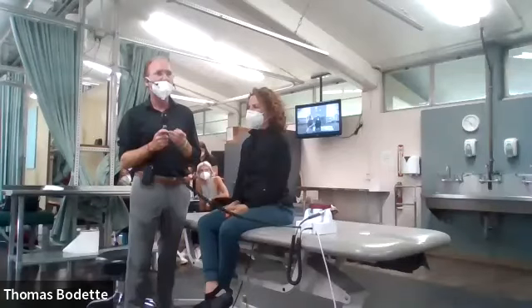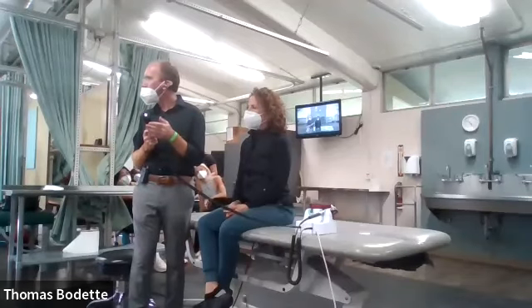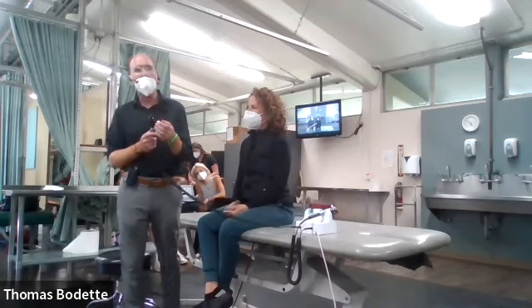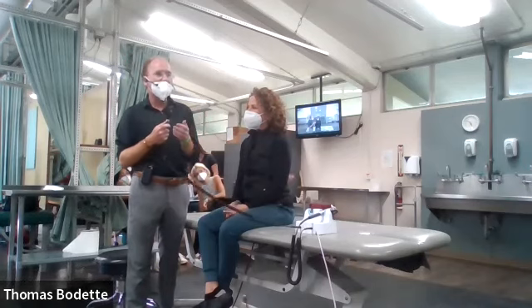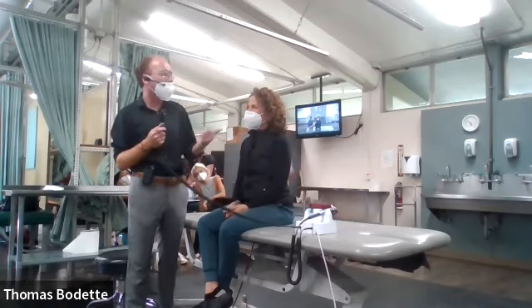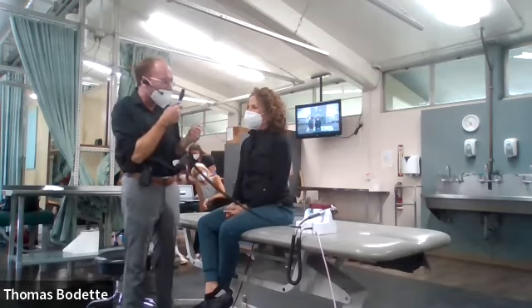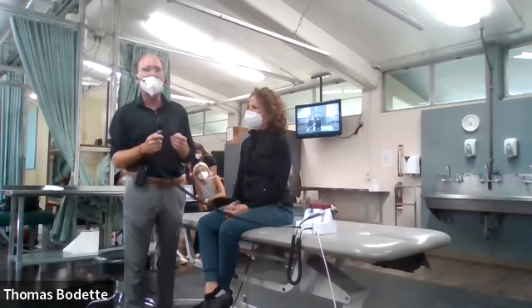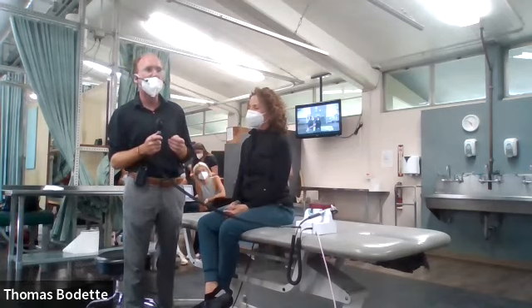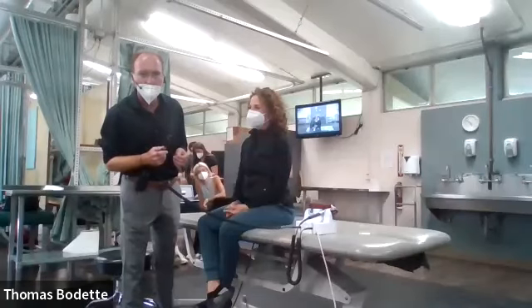Why is that? Because if you're using a traditional ophthalmoscope that's not the Welch Allyn PanOptic or other more sophisticated pieces of equipment, as close as you need to be, you run the risk of possibly making your mask have contact with hers. You don't want to be looking through the left and examining their right, because you're going to be right in front and your lips might touch, and that's not good for business. That was kind of a joke, but also kind of serious.